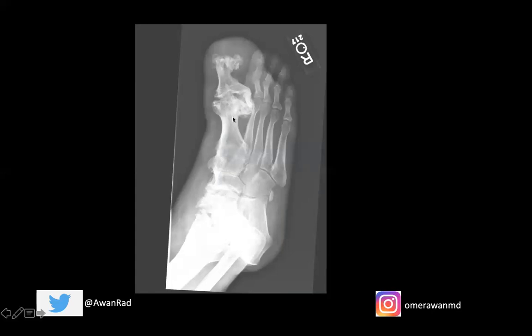This is a nice case of what macrodystrophia lipomatosa can look like — it really is just a form of focal gigantism. You can have bowing deformities associated with this. There's no real known cause and it's not hereditary — it's likely multifactorial, present at birth and continuing to grow through puberty. Typically, they can surgically debulk the excess redundant fatty tissue as a treatment for this entity.